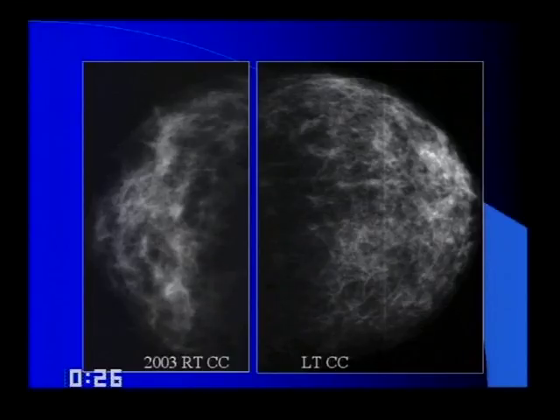Okay. What else can we do? If you're looking at a nodule on a chest x-ray, what's the first thing you're supposed to ask? Sort of the first thing you ask on a mammogram, too. If you have a questionable abnormality, what can you do first before we do the additional views and ultrasound?